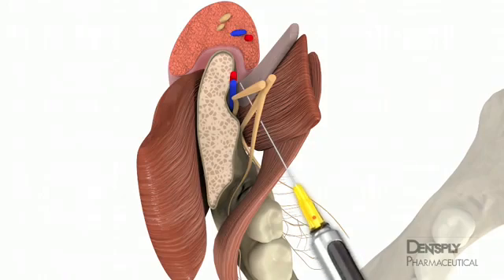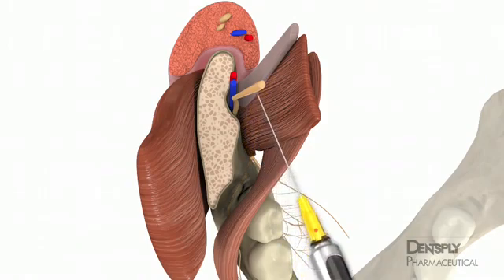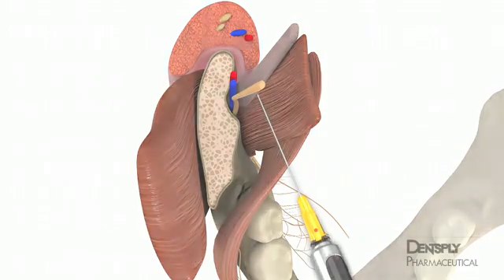Deeper insertion is not advised because of the potential for penetrating the parotid capsule and anesthetizing the facial nerve. Depositing the anesthetic at this point will still usually produce mandibular anesthesia. In the few instances when anesthesia is not obtained, perhaps because the sphenomandibular ligament and attendant fascia prevent lateral spread of the local anesthetic, re-injection will be necessary.